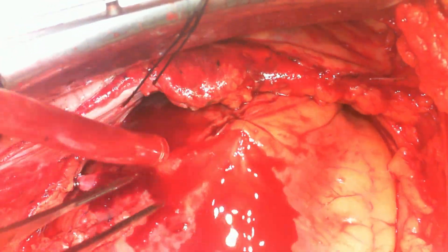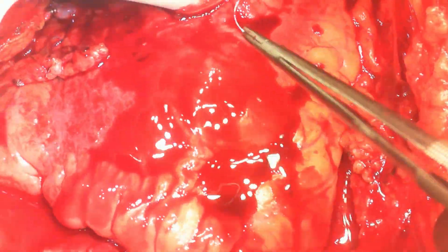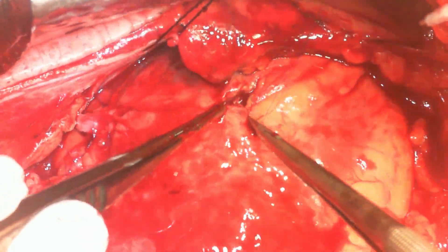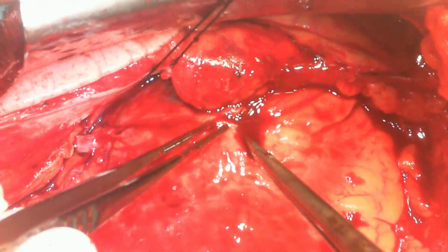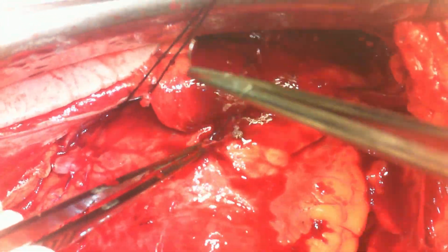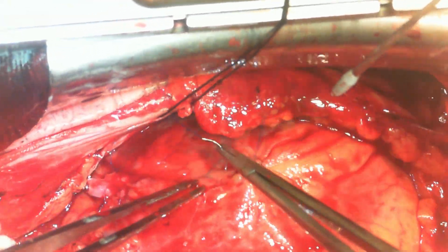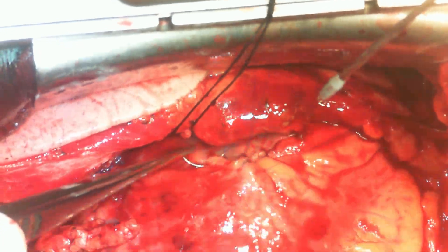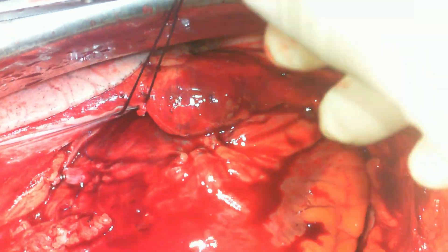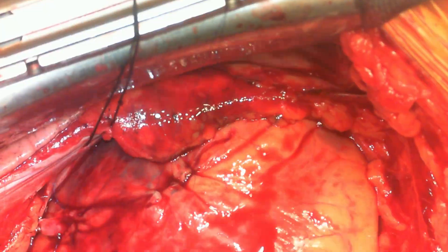This parallel bite stops the bleeding. As you can see, through the small hole there is some amount of bleed, but this will stop with the parallel bite. You need not tie the knot — just approximate the suture, put it on a bulldog, and let it hang by its own weight. By doing so, the bleeding will be controlled and you will have enough time to establish cardiopulmonary bypass, empty the heart, arrest the heart, and manage the bleeding with the heart in a rested, placid state.